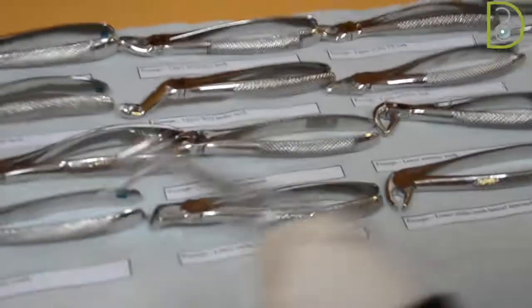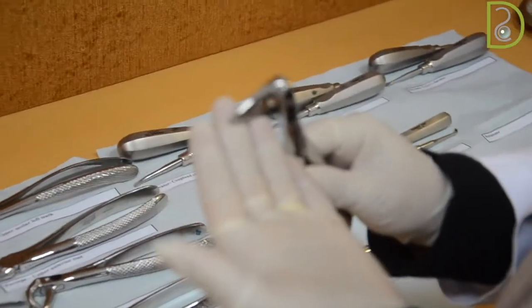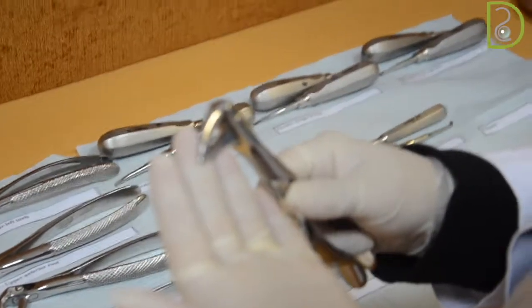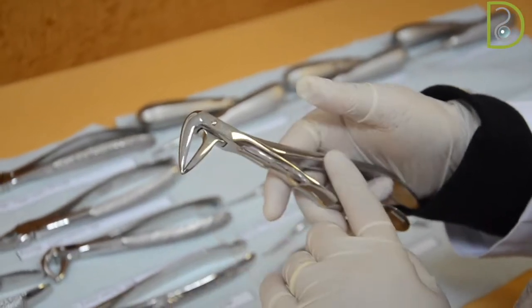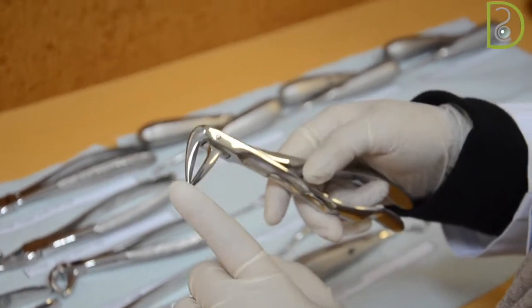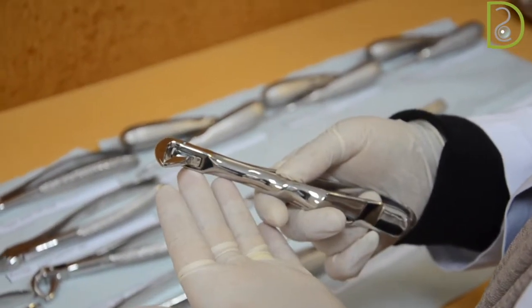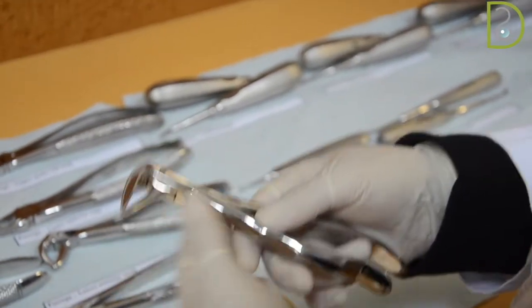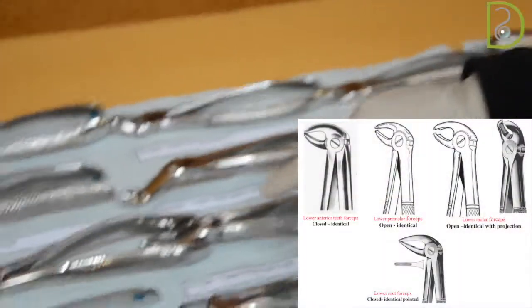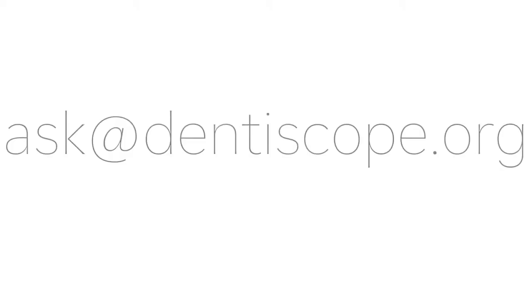Now coming to the last forceps, which is the lower root forceps. Most of the lower roots don't need to be approached other than with a perpendicular angle to the handles. So all of them will be grasped with this kind of forceps, not like the upper arch, where we need a curvature to reach the posterior and a straight handle to reach the anterior ones. I hope this video was beneficial for everyone.